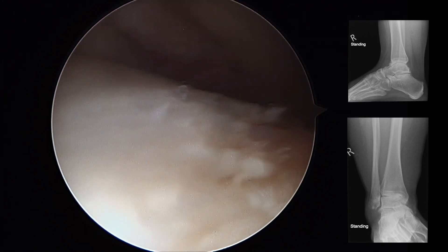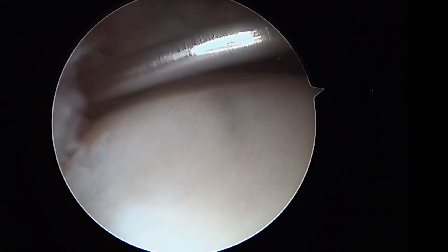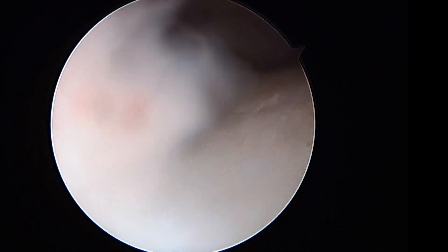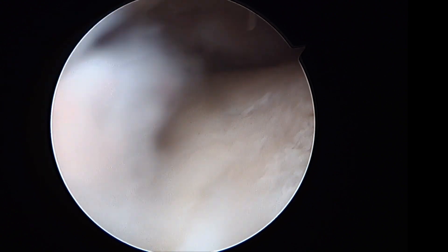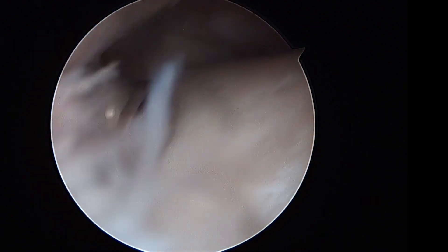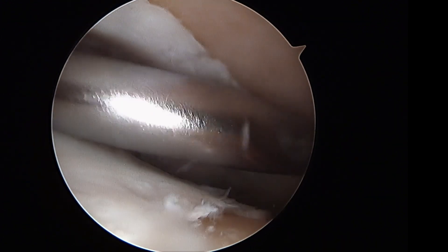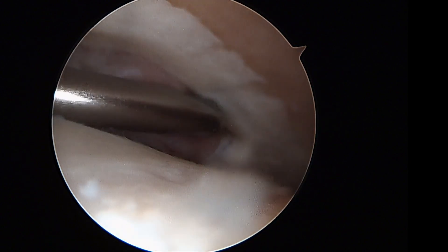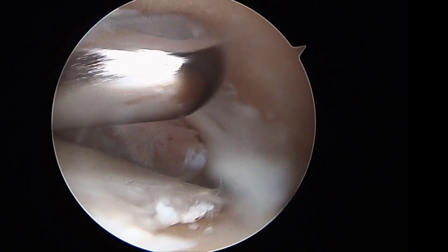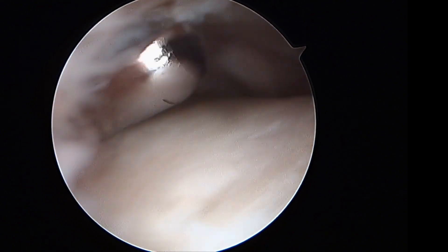There is some synovitis as expected. Through the lateral portal, a needle is inserted followed by the arthroscopic soft tissue shaver — a full radius resector. The first step is to clear the soft tissue gutters, perform synovectomy, and deal with soft tissues before addressing the cartilage. The full radius resector is then used to denude all cartilage in a systematic fashion.